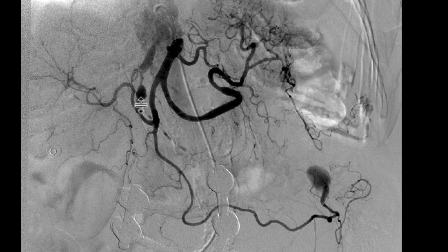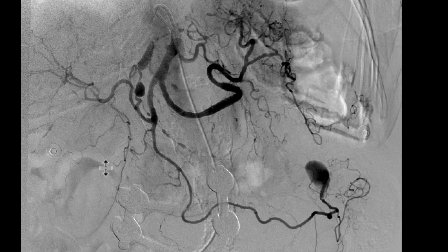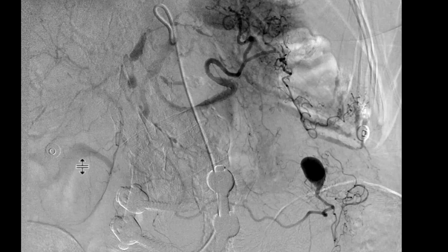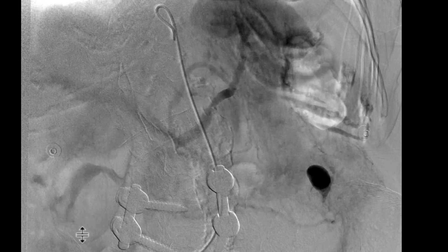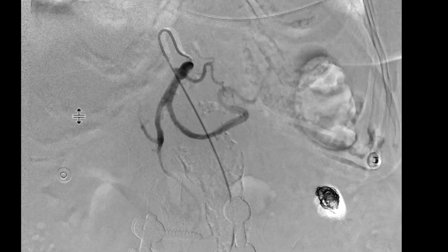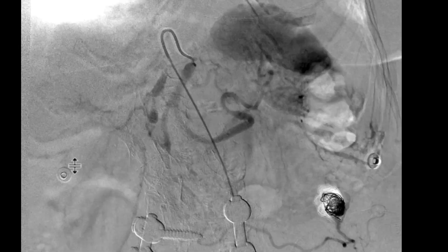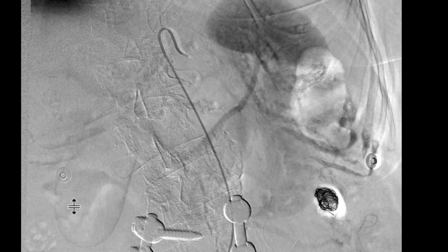We can see an additional aneurysm in this instance arising off the left hepatic artery, as well as some irregularity of some of the other vessels. This was subsequently coiled, as can be seen here, with good treatment effect and patient outcome.